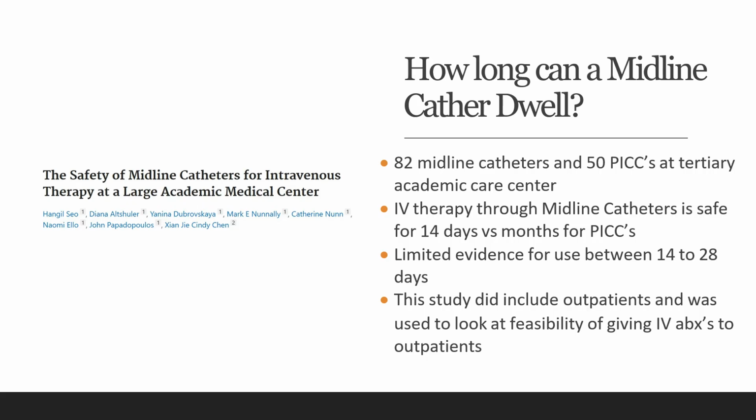So in this study, they had 82 midline catheters and 50 PICCs at a tertiary academic care center. IV therapy through midline catheters is safe for about 14 days versus months for PICC lines. There's limited evidence for use between 14 to 28 days. So the study did include outpatients and was used to look at feasibility of giving antibiotics to outpatients. So this could be a good way to kind of go to your administrators and be able to prove to them that this is a catheter that could prevent hospitalizations and maybe save them some money.